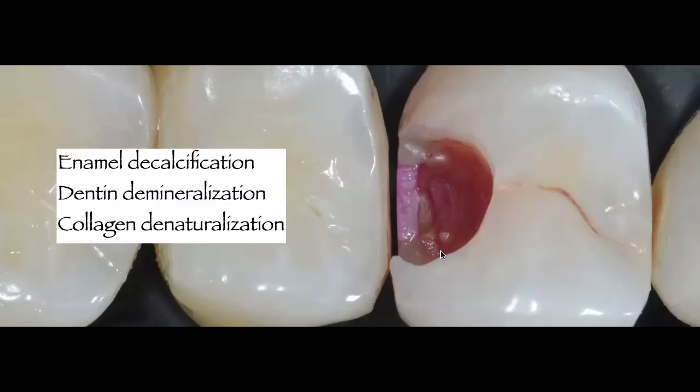So I'm seeing now, okay, there's some more caries left on that enamel, which is critical. I don't want to have caries on my enamel. I want to make sure that everything is nice and clean. But also, there are those 1 to 2 millimeters of dentin beyond the DEJ, beyond the junction of that enamel and the dentin, that is also stained red with my caries detection dye. What does that mean? Red staining means that this is denaturalized collagen, and that's what helps me separate or identify the outer caries dentin from the inner caries dentin.